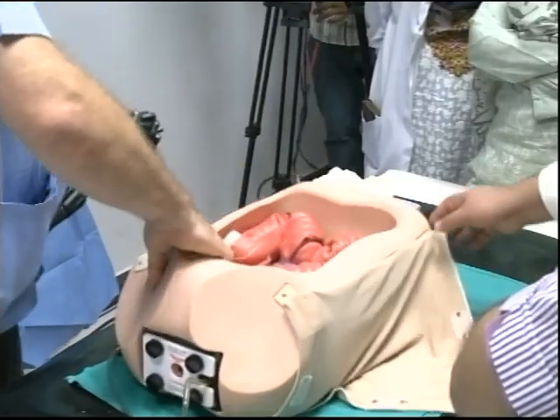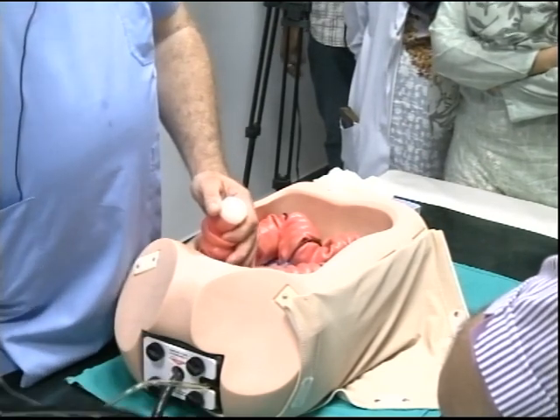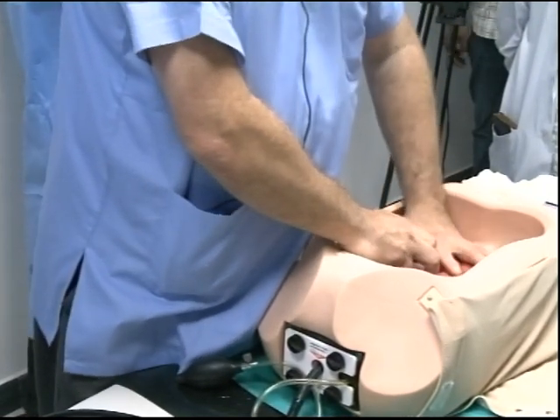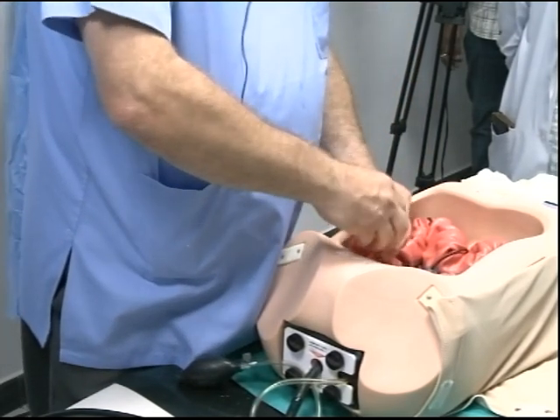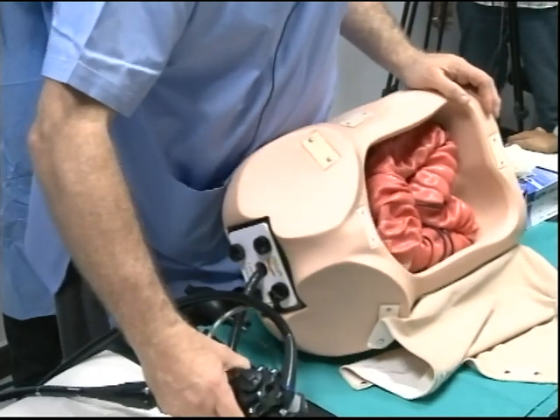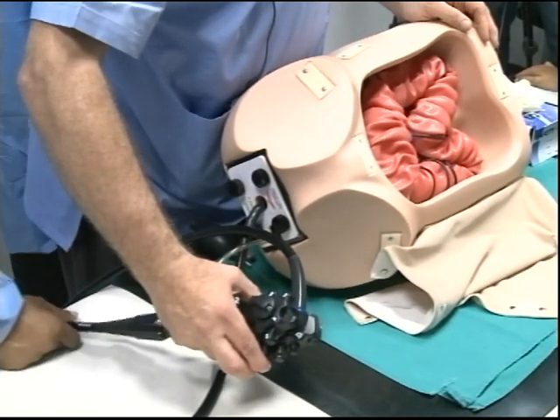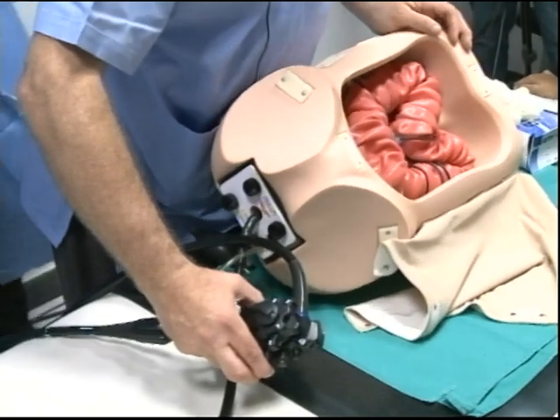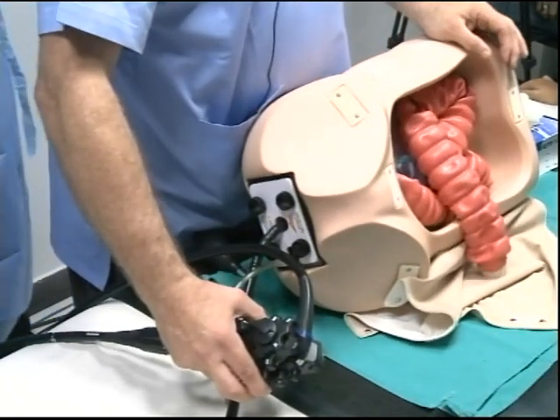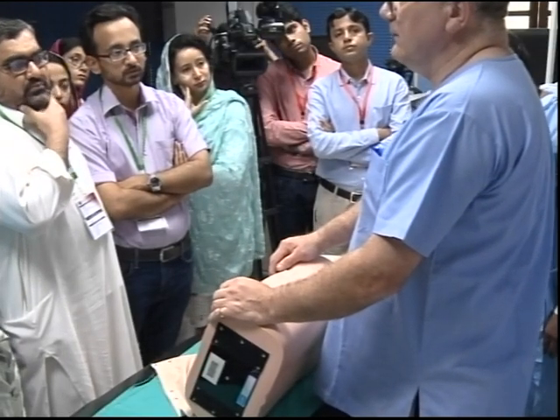What I want you to see is how quickly this happens. Let's pop the scope just here. Let's make the person grip down on the scope. That's gripping down on the scope. Let's let some air out before we do anything else. So we've let the air out. Let's put the person in the left lateral. One, two, three, four, five, six, seven, eight, nine, 10, 11. What's filling up first? 13, 14, what's not filled up yet? 18, 19, and how many of you would be in the cecum in 18, 20 seconds? No one, okay.